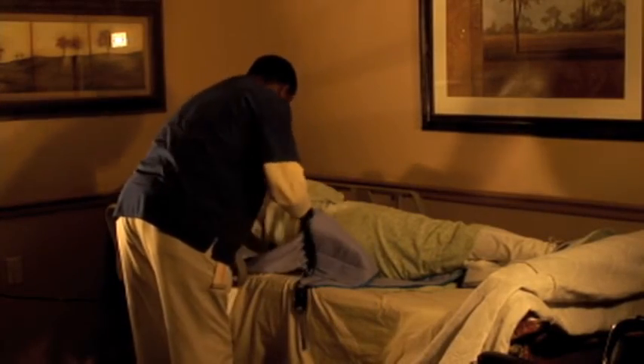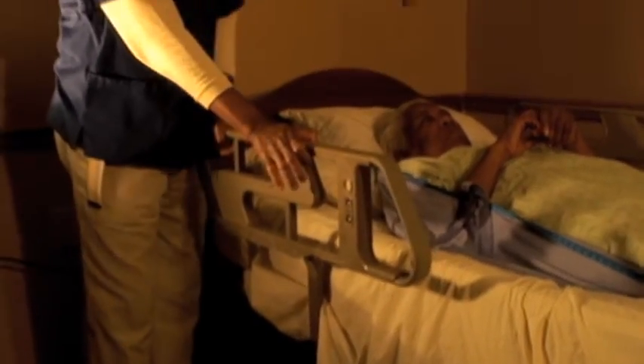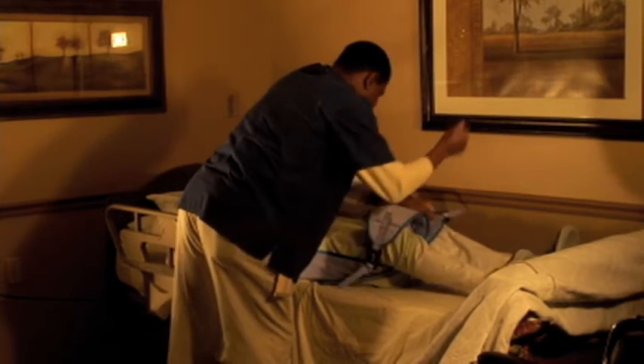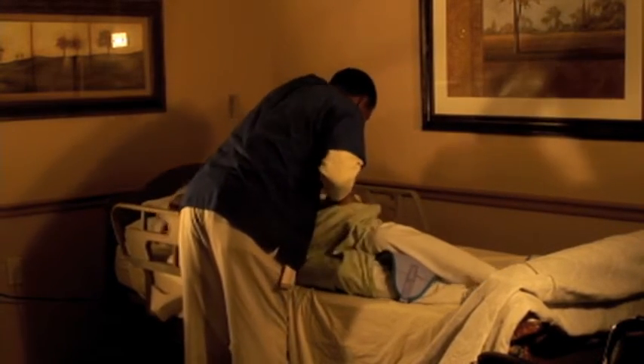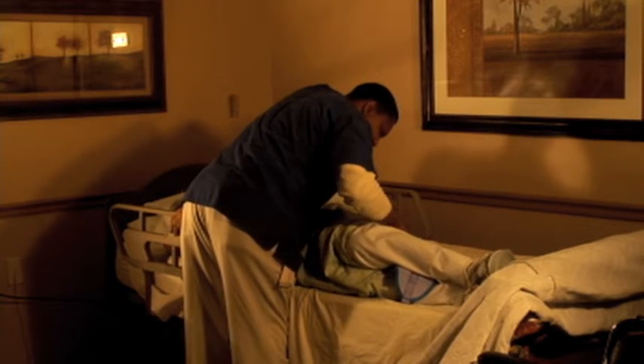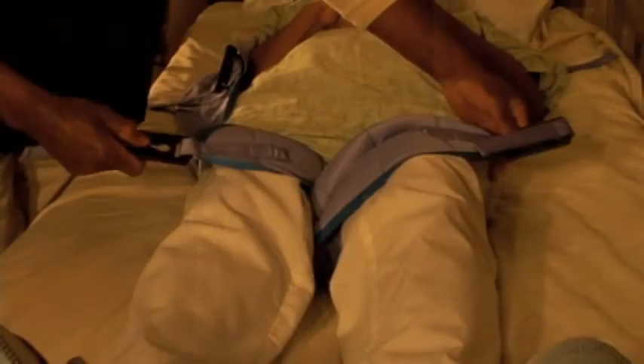To properly use a full body lift, first, the resident must be placed on the sling, which is a strong nylon piece of fabric, much like a hammock. At each corner is a loop with a hook that is attached to the arm of the sling. Position the sling underneath the resident by tilting the resident to the side. Make sure the rail is up and slide in the sling horizontally. Tilt the resident to the opposite side and pull the sling through so two loops are exposed on both sides. The top of the sling should sit around the shoulders and the bottom approximately mid-thigh. It is important to smooth the sling to minimize discomfort.